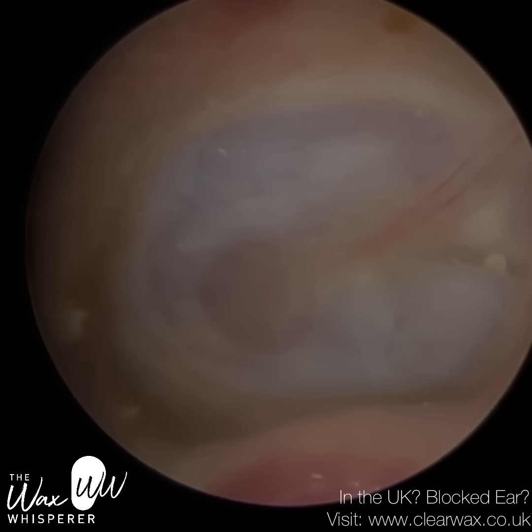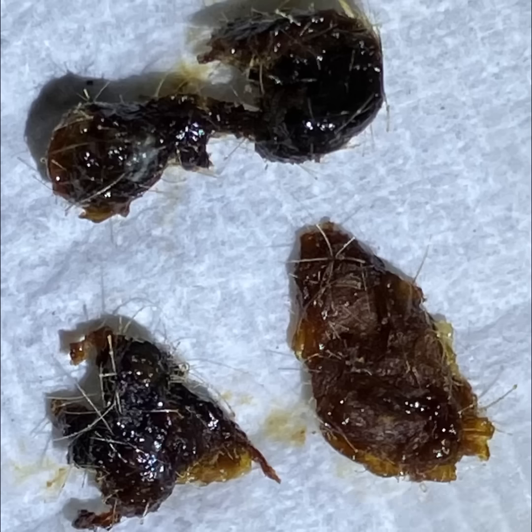But centrally on the eardrum, there's evidence of a healed perforation just below centre, underneath the umbo — which is the part of the hammer bone that attaches to the eardrum. So that's all the wax from the patient's left ear.